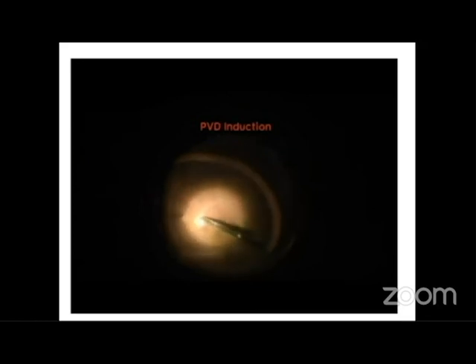Core vitrectomy is done. One point to note in CMV retinitis with retinal detachment is that spontaneous PVD rarely occurs, and posterior hyaloid is adherent to the membranes. PVD is induced meticulously. Membranes are dissected transversely to relieve anterior, posterior, and tangential traction.